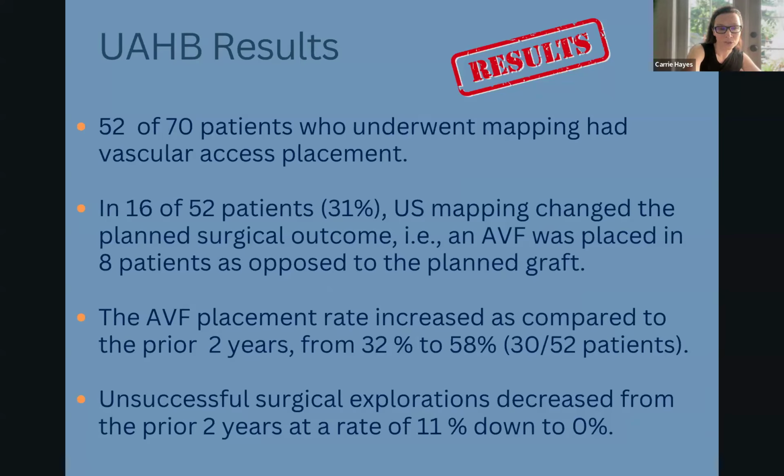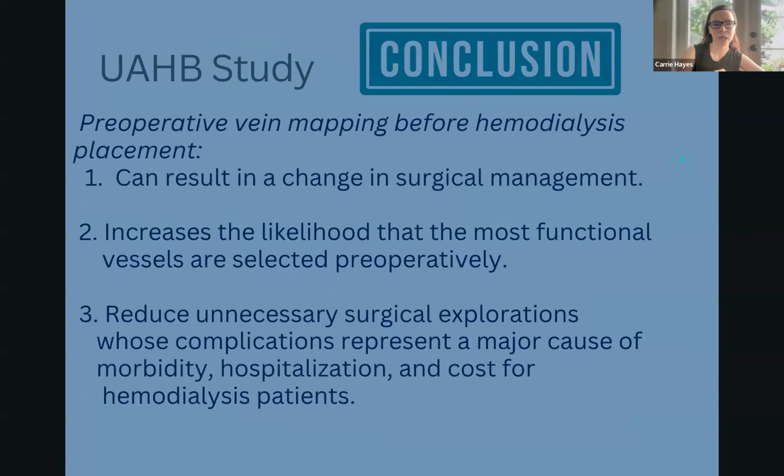So over half the patients. And then unsuccessful surgical explorations decreased from the prior 2 years from 11% to 0. So basically, they didn't need to look around in there and figure out what they were going to connect. They had the right information going in.